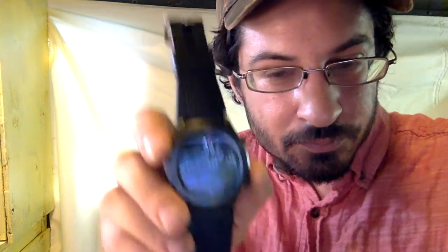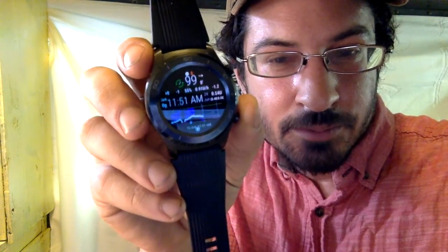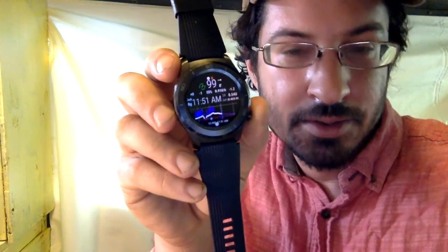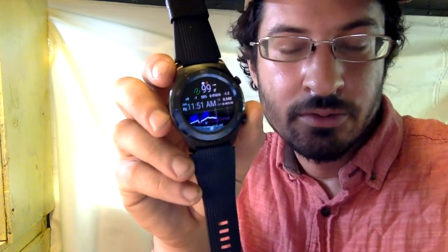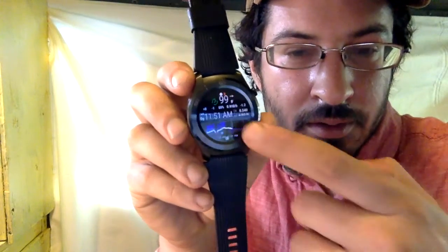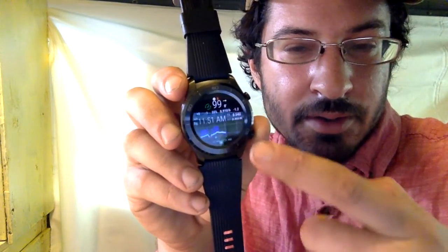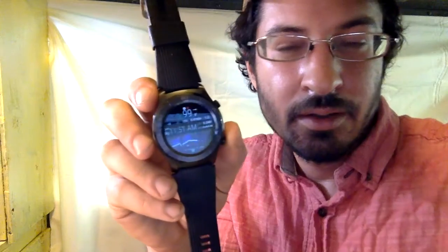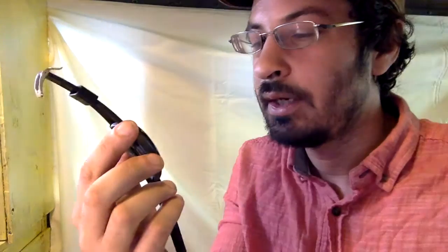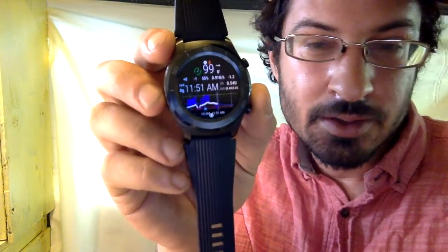So this is the watch. A lot of cool data there. You see the 99, 0 minutes ago. Underneath the arrow is a 0. Change from 5 minutes ago is plus 0. So right there, that plus 0. And I think the -1 is change from 15 minutes ago or expected change, one or the other. And then that 55 is the battery life of my phone.